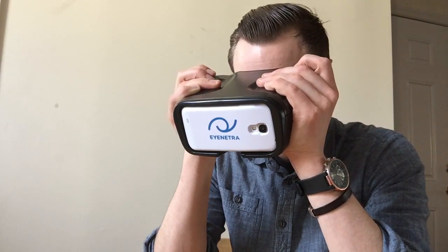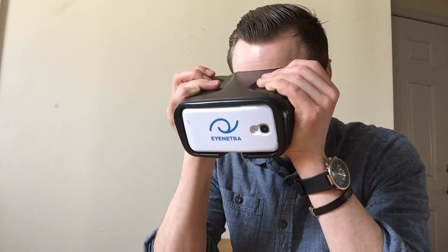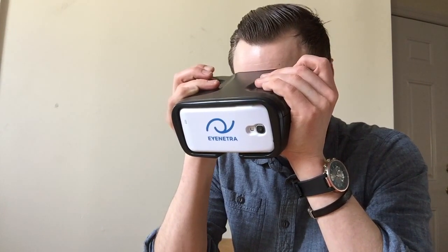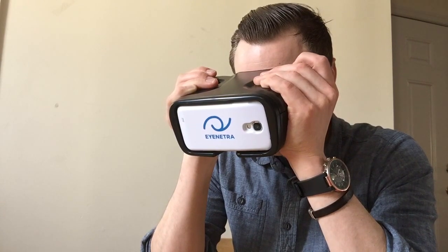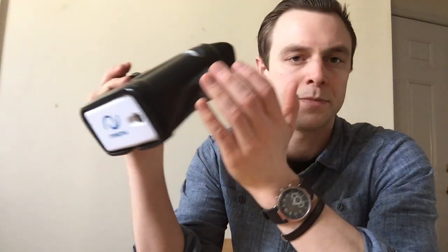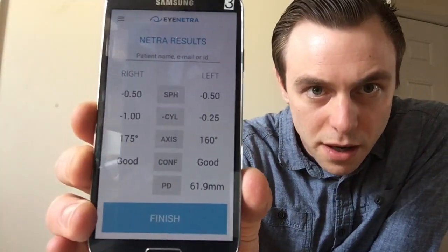Making sure I adjust the right knob and then the left and then click. The device gives progress updates — halfway done, three quarters of the way done. Some people have described this as similar to a video game because you're essentially lining up some lines at different axes using the controls. Once finished, I pop out the phone and my results are displayed right on the face of the phone.